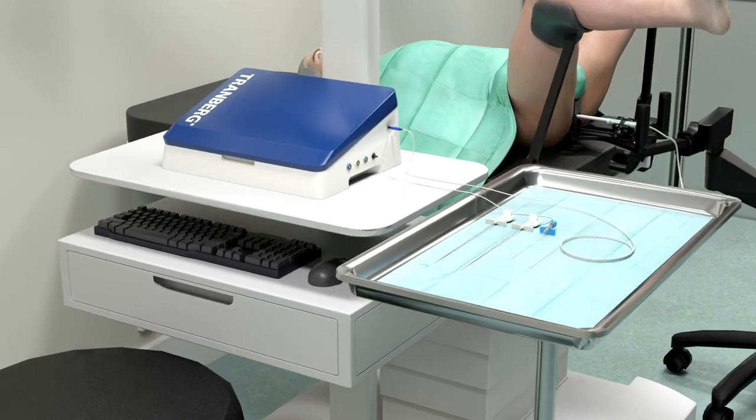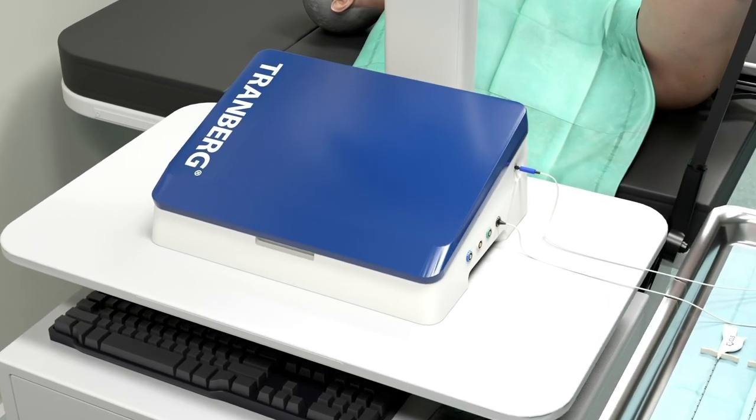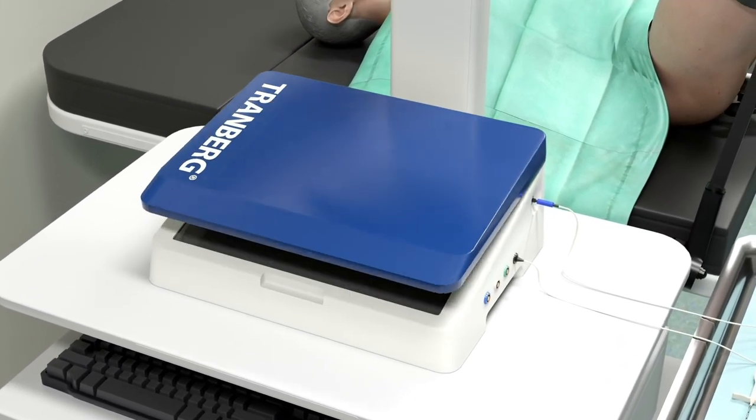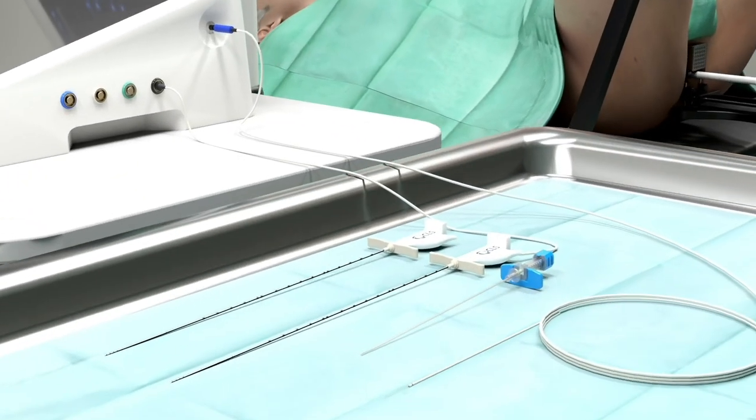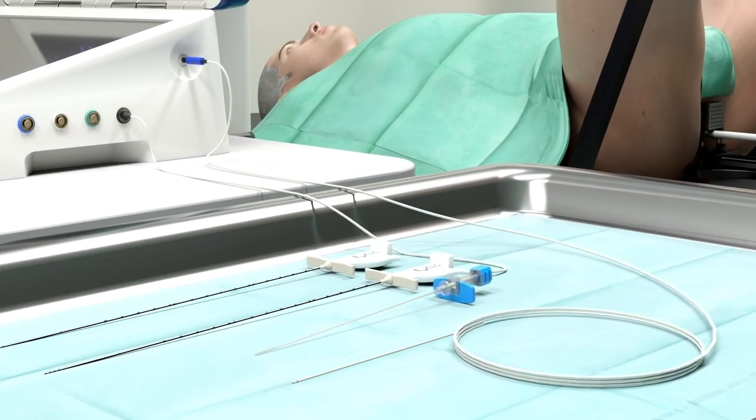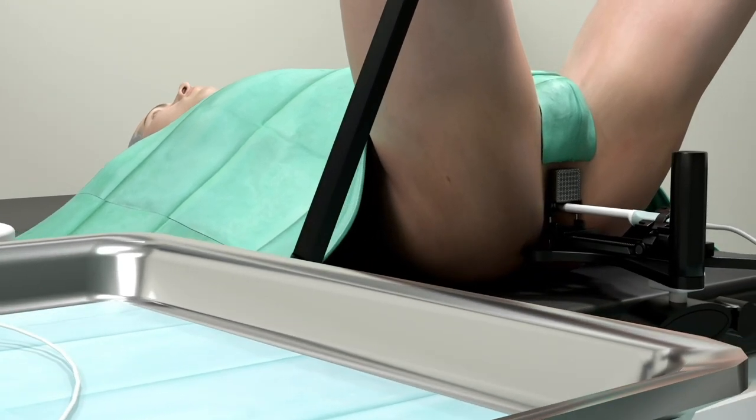The equipment required for the procedure includes the Tranberg Thermal Therapy System, consisting of the laser unit and single-use laser applicators, a biplane transperineal ultrasound, and MR Fusion or micro-ultrasound of the doctor's choice.